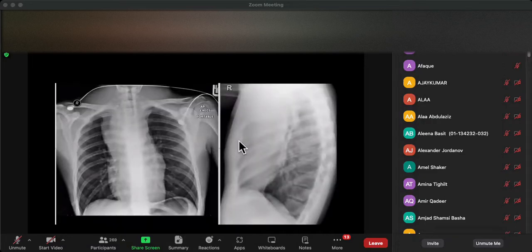Another example of an anterior mediastinal mass. This time we can tell it's anterior on the lateral because we've got filling in of the airspace, and we've got the hilar structures, in other words, the blood vessels are still visible, and yet there's a mass lesion in the atrioventricular groove, and we've got loss of the right heart border, yes, again, because of an anterior mediastinal mass. So this also turned out to be lymphoma.